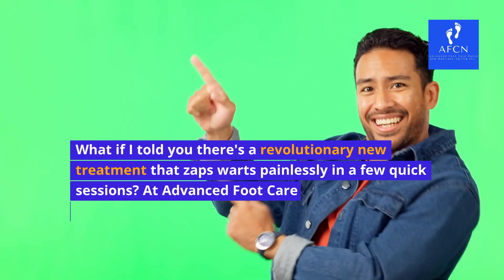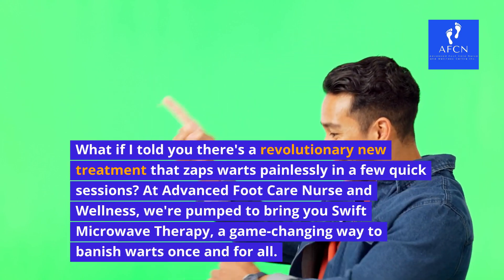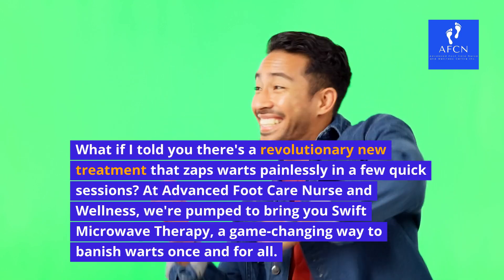What if I told you there's a revolutionary new treatment that zaps warts painlessly in a few quick sessions? At Advanced Foot Care Nurse and Wellness, we're pumped to bring you Swift Microwave Therapy, a game-changing way to banish warts once and for all.